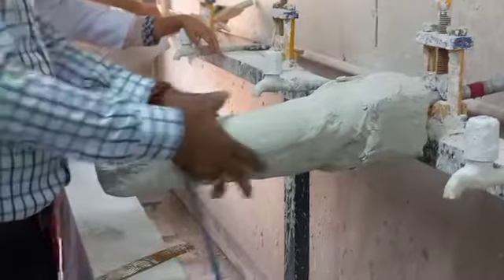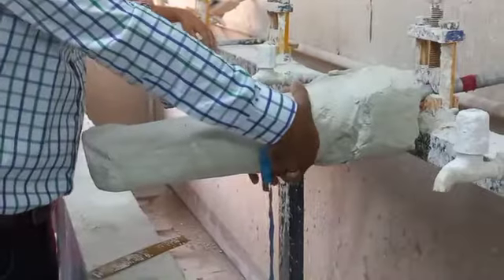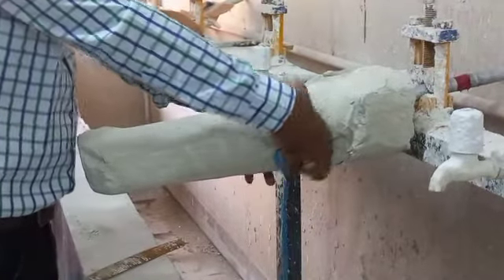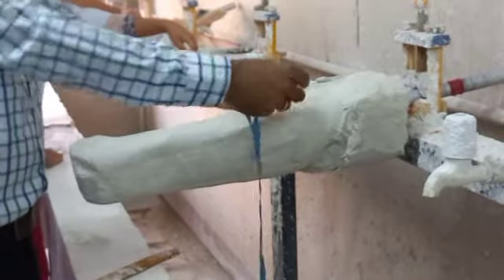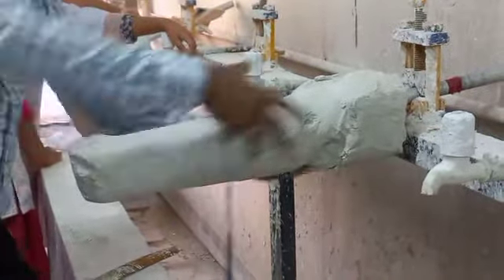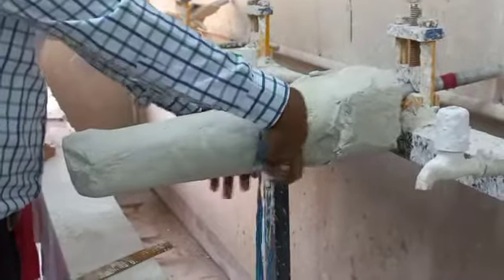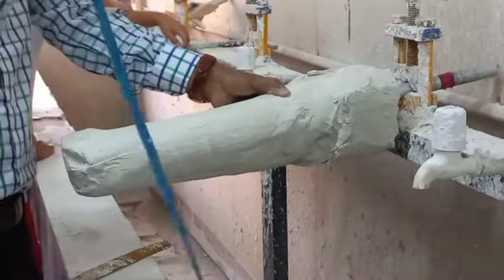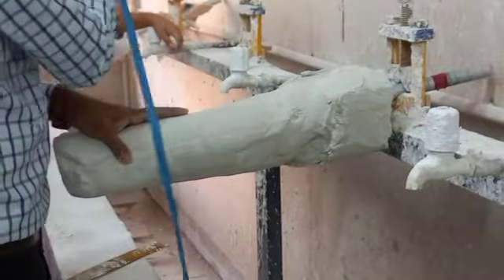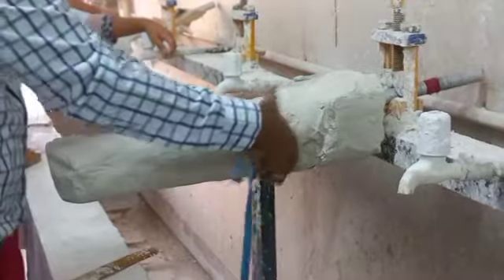So normally we do not disturb it. But let's say in this area, the patient's circumferential measurement at this particular level was 50 centimeter, and my initial measurement that I took is 55. So I know that I have to do a global reduction all over this area, so that it becomes almost 50 first. It should come to 50, and then I will reduce to the percentage reduction level in the particular area.